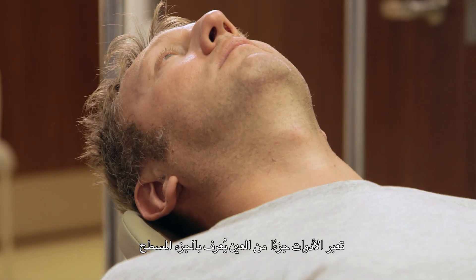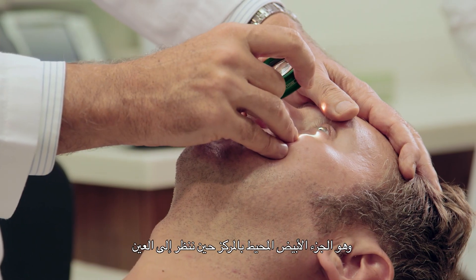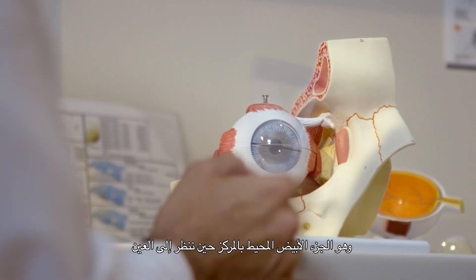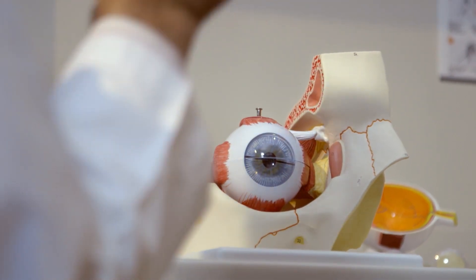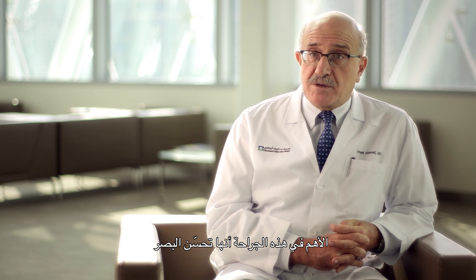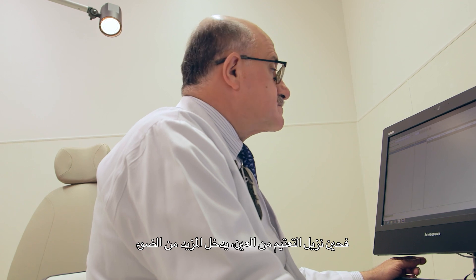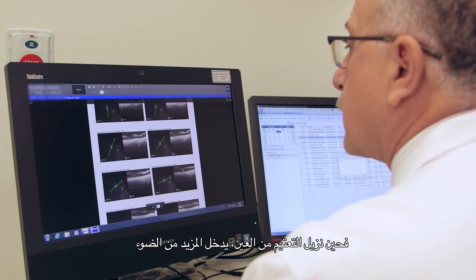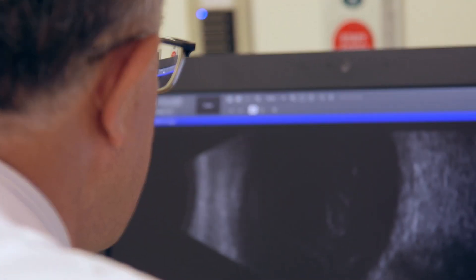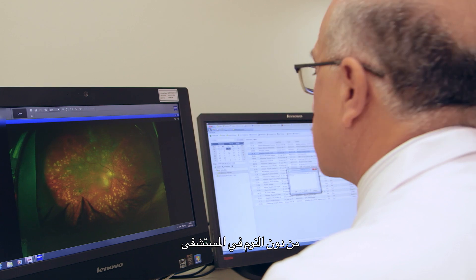The instruments go through a part of the eye that we call the pars plana — the white area that surrounds the center that we look through. The most important benefit from this surgery is visual improvement. As we remove the opacity from the eye, it allows light to get in and the patient sees better or clearer.